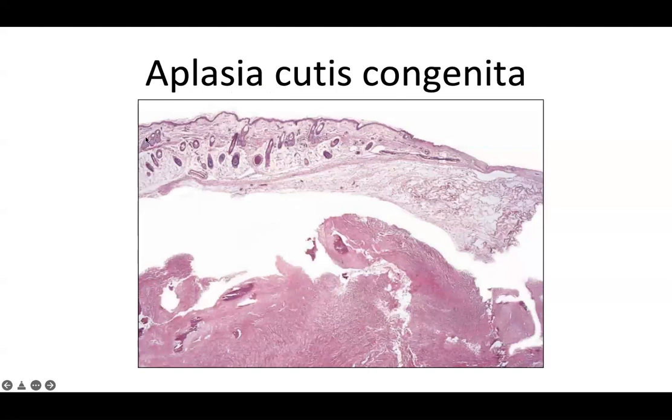So you can see a drastic change from the upper left part of the epidermis where you've got some pilosebaceous units, some follicular units, but they look pretty superficially located because these anagen hair follicles are actually within a subcutaneous region, but the overall thickness of the skin is quite decreased. And then over here to the right, you just have this granulation tissue and necrosis and complete absence of pilosebaceous units and adnexal structures. And underlying that, you also have diffuse fibrosis within the tissue.